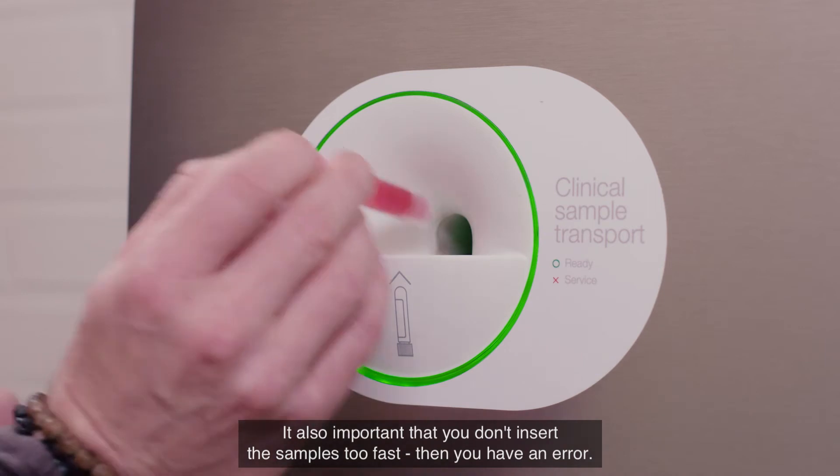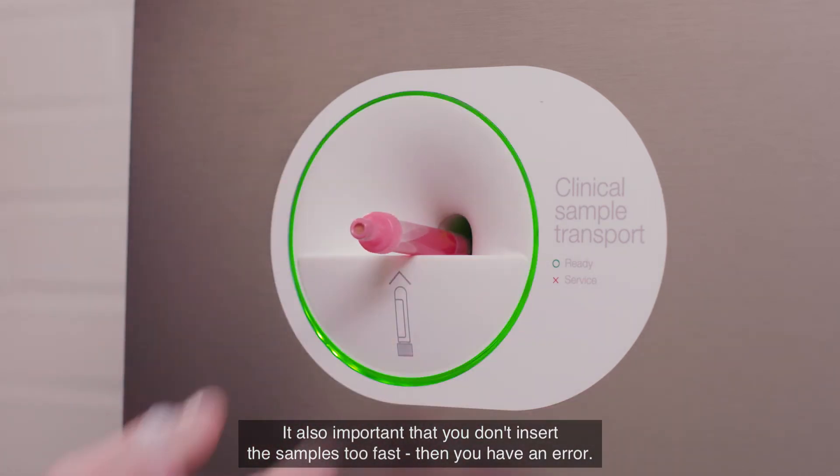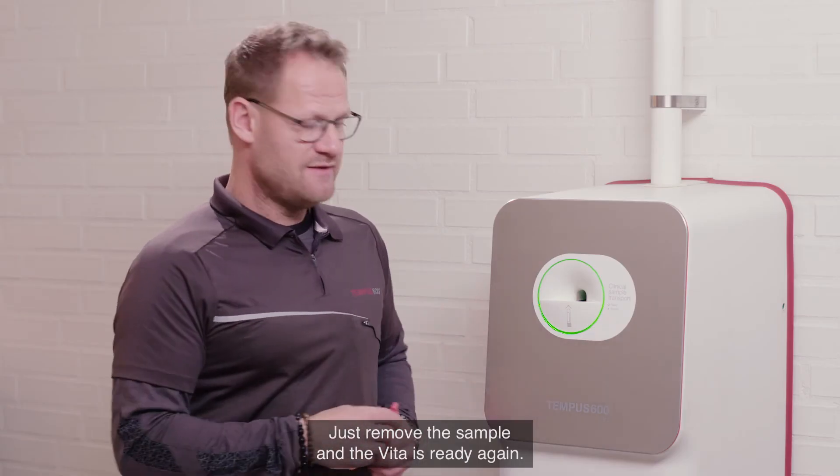It's also important that you don't insert the samples too fast, as that will trigger an error. Just remove the sample and the Vita is ready again.